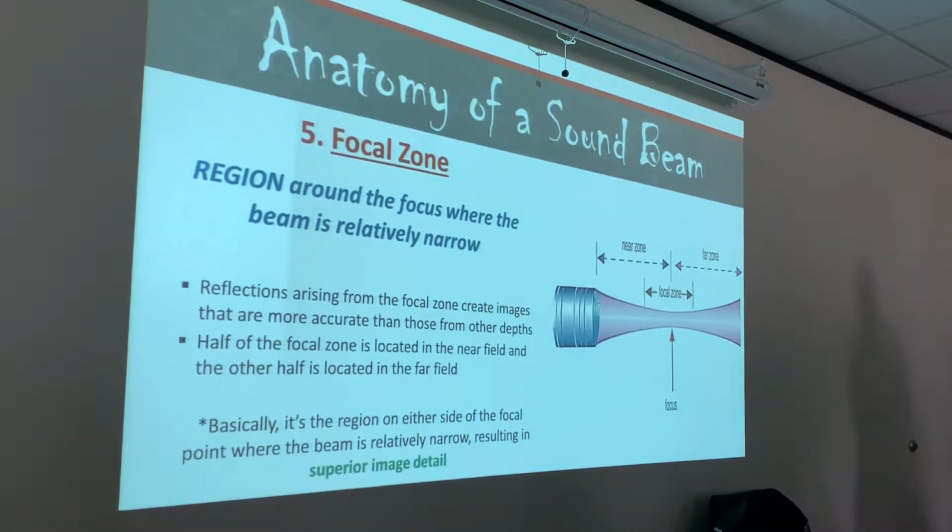Again, like the picture I drew up here, if the two structures are wider apart than the shape of the beam, then that beam is going to be able to identify those structures, right? But if those two structures fall outside of that beam, then it's going to represent them as two different things. Okay?